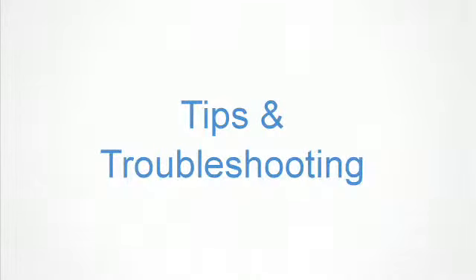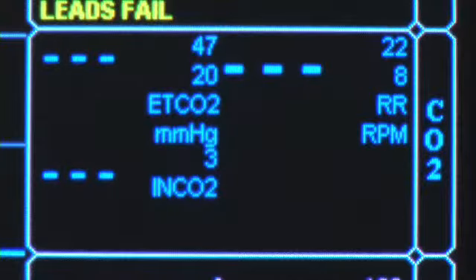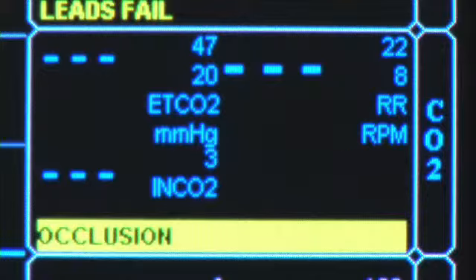Tips and troubleshooting. CO2 module occlusion. If occlusion in the CO2 sampling occurs, an occlusion message is displayed on the CO2 parameter display. There are 4 accessories to inspect when this occurs.